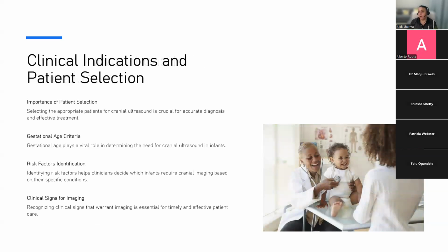I think what we've got to be careful about is that when we choose a particular neuroimaging technique in a neonate, we've got to understand that there is a limitation, not just from the fontanelle, but actually from the baby's clinical condition as well. It may not always be possible because the baby might not be stable for us to do a lot of handling to be able to get a good image.